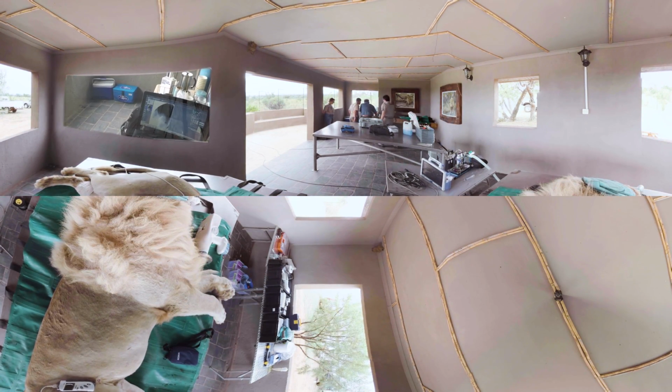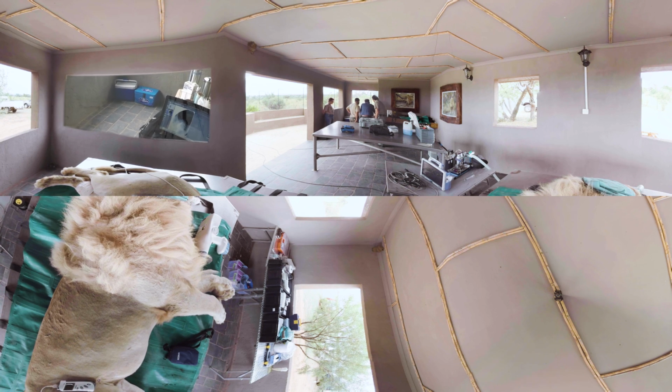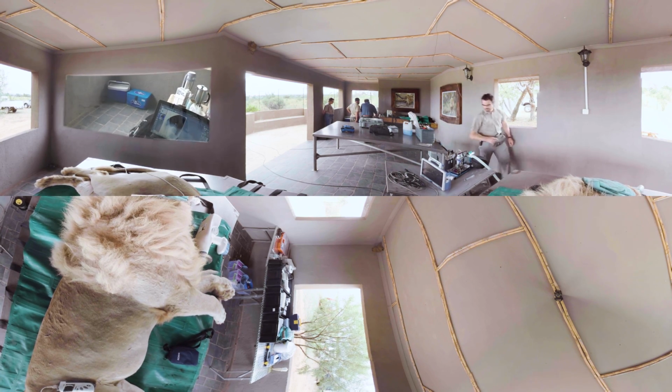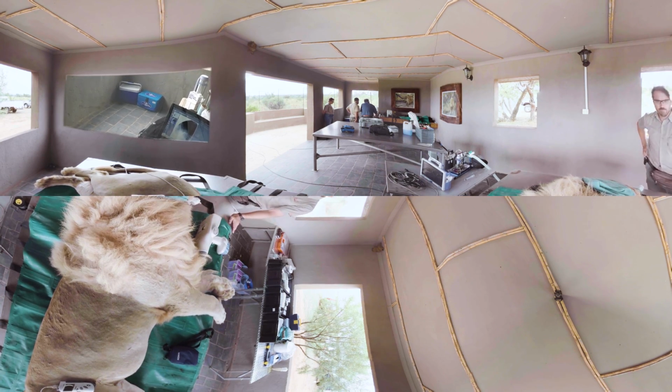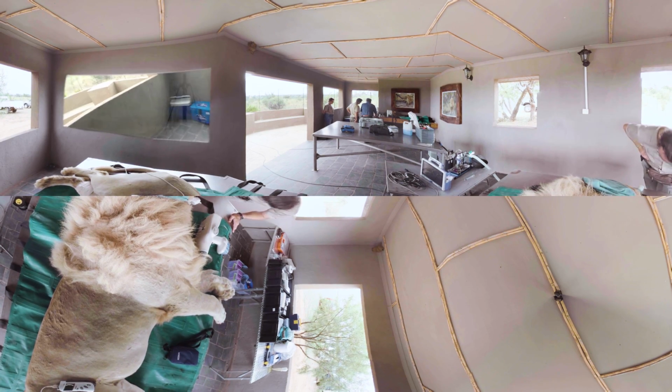That's the periodontal ligament space, and look how nicely you can follow it virtually all the way around this tooth. It's all nice and compact. That's the normal periodontal ligament space where the periodontal ligament would be. I think you'll remember earlier in the week, some of those had big areas where the bone was eaten away, and there's nothing of that. The filling is still very nice right to the apex, so that to me is a sound tooth. There's nothing wrong with that. It's a happy tooth. Great.